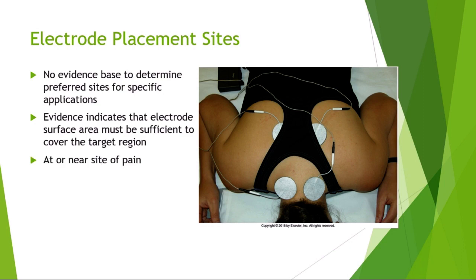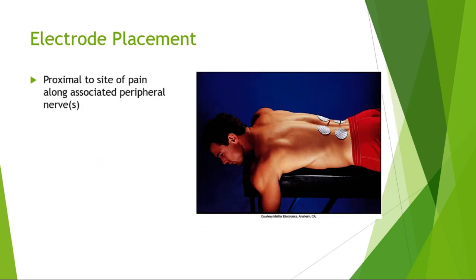It should be at or near the site of pain. There's another duh moment right there. Or surrounding or bracketing the site of pain. So the evidence talks more about covering the target region than specific electrode applications. There is a theory that putting it proximal to the site of pain along the associated peripheral nerve is going to be effective. Again, not proven in the evidence base.